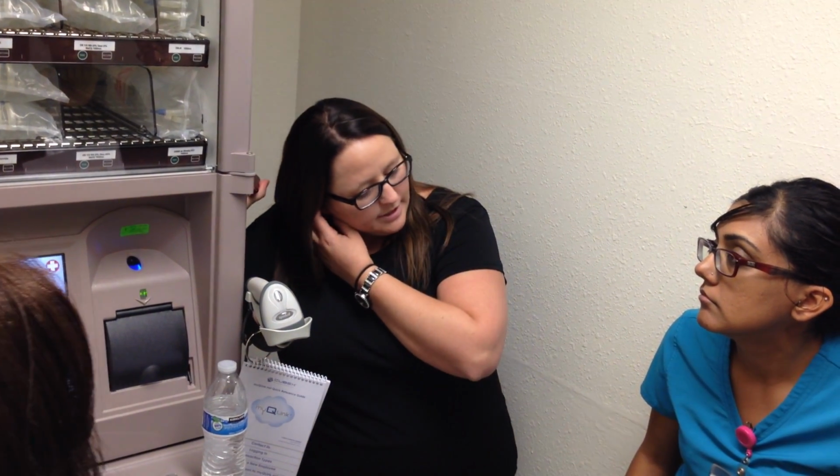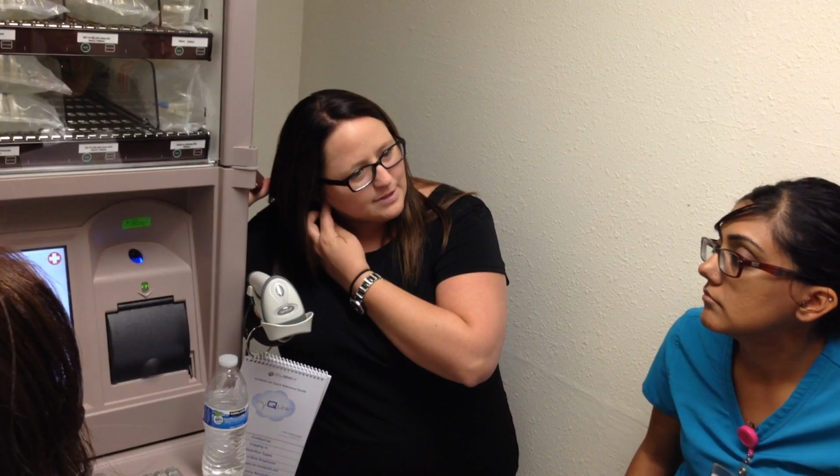Everything issued out of this cabinet will always be issued to a patient. You'll never be taking out anything otherwise. Everything is monitored, and I have access to this cabinet and what's going on in it from my phone. So we monitor these and we know exactly what's going on. So no funny business, please, because we will know, and as a pharmacy, we will prosecute.